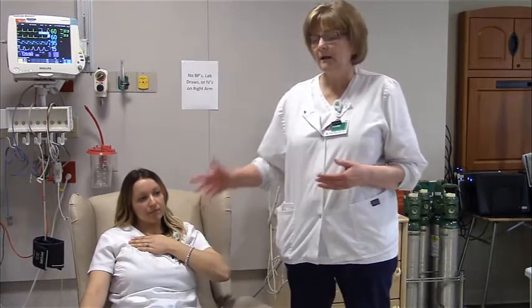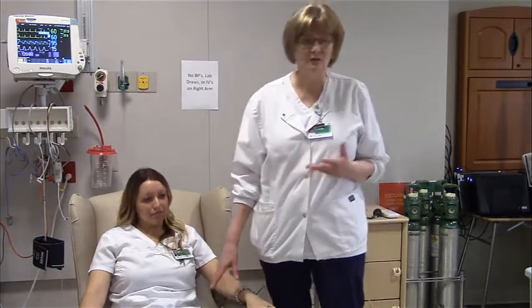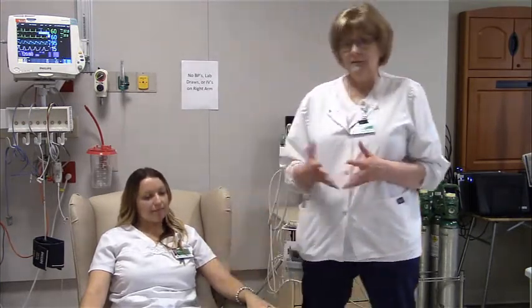Now, a lot of times your patients will pattern their breathing, so that's why you have to be a little bit on the sneaky side in order to obtain respirations. All right, now you practice this in class as well.